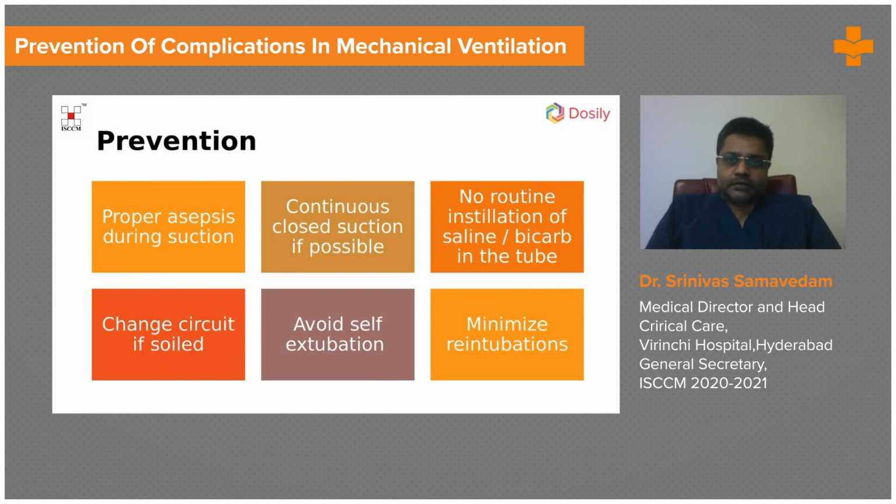In a COVID situation, the risk of aerosol generation is very, very high. So in this situation, it is strongly recommended that all patients who are mechanically ventilated should have a continuous closed suction to prevent the risk of exposure of the healthcare workers to aerosol.